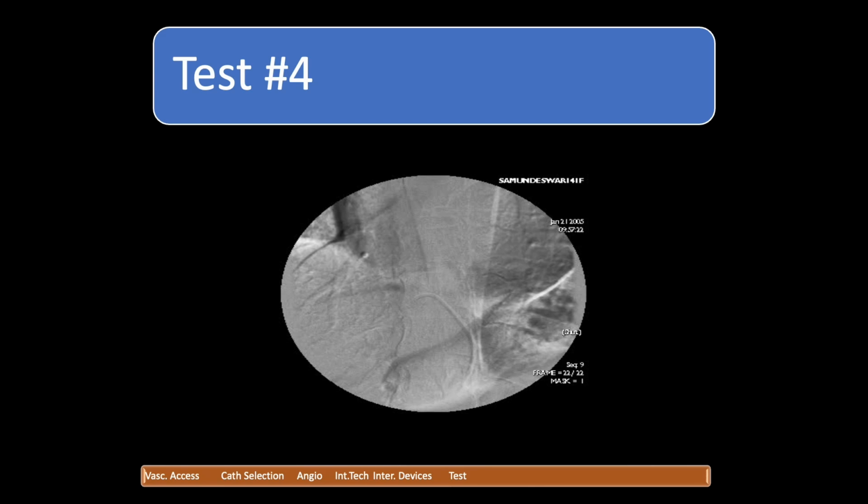So then, this one, there is a branch which is going laterally. What should that branch be? It is quite long, going laterally. Once again, you see which level it is, the rib is seen, because in subtraction it is difficult. Still you can see the diaphragm. It's not a very big artery, going between the intercostal space, going down below the diaphragm. It is an intercostal artery.